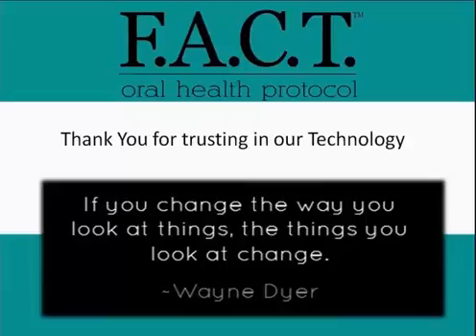And so that's the same thought process as we present this to our patients. We just let them know we're doing an oral cancer screening. We have a technology that allows us to do a better job at that screening, or we've recently invested in a new technology to allow us to see things that we can't see in a regular exam. And so we can better stay on top of things.